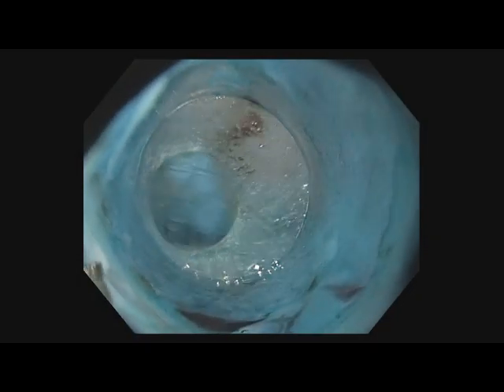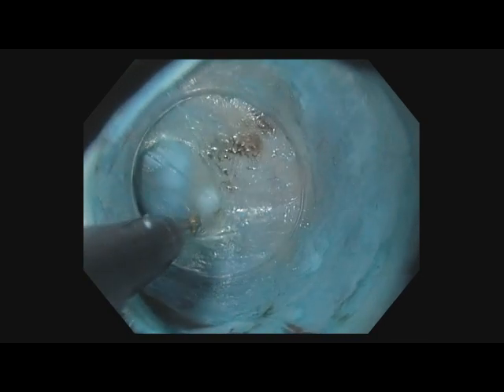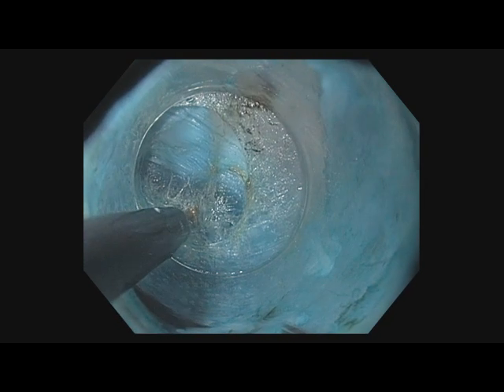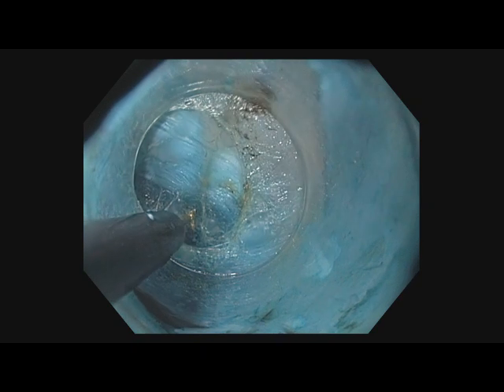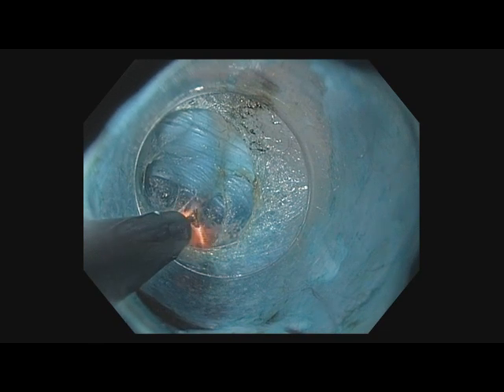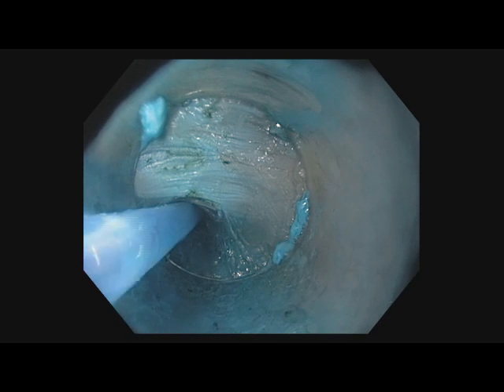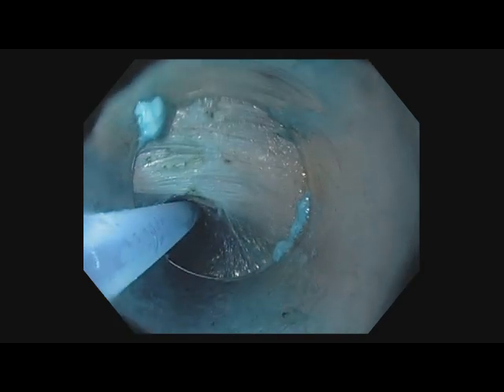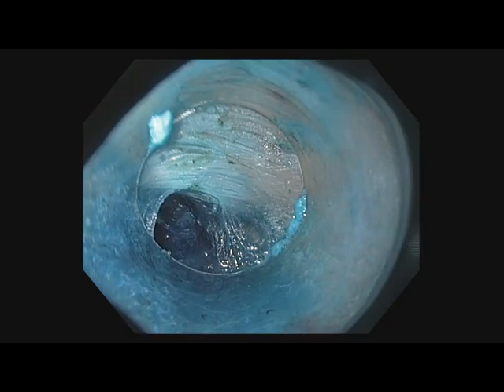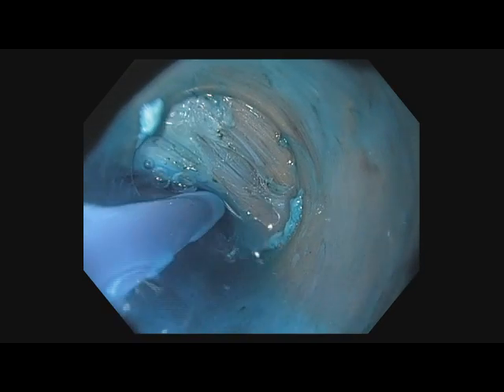The scope is then maneuvered into the tunnel. A combination of electrocautery and hydrodissection are used to create a 19 cm long submucosal tunnel. In this patient, the tunnel is performed on the posterior wall of the esophagus to avoid the prior hilar myotomy site.